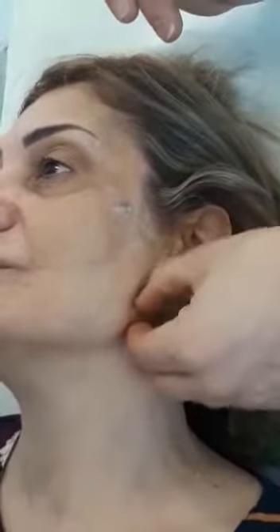Good fixation. Don't go here. Here there is no fixation. Do you mean that we have one insertion entrance for this part and one for this part? Yes, one entrance for every thread, even if I want to use many threads. No problem.